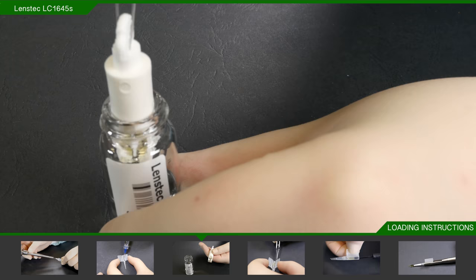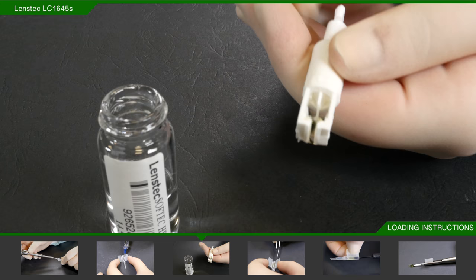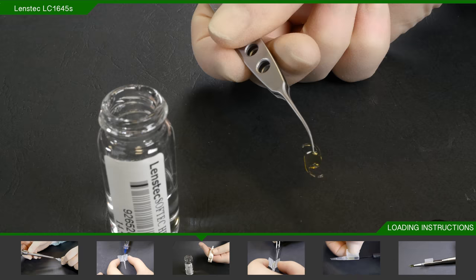The injector and cartridge are now primed and ready to load. Remove the lens holder from the bottle. Pull back the plunger that holds the lens in place, and using McPherson's or any non-tooth forceps, remove the lens.